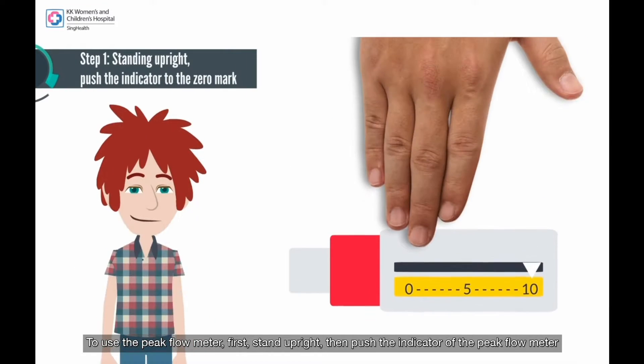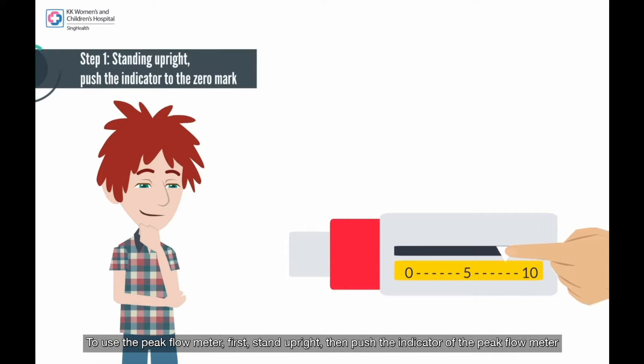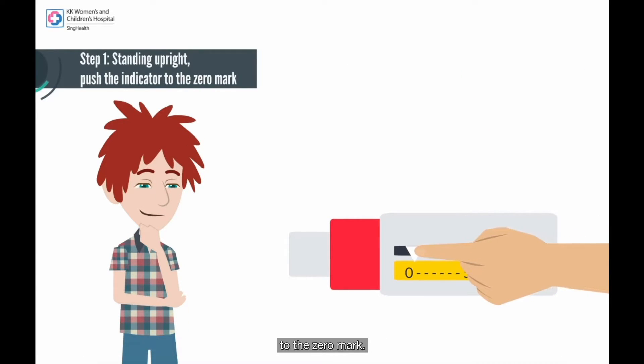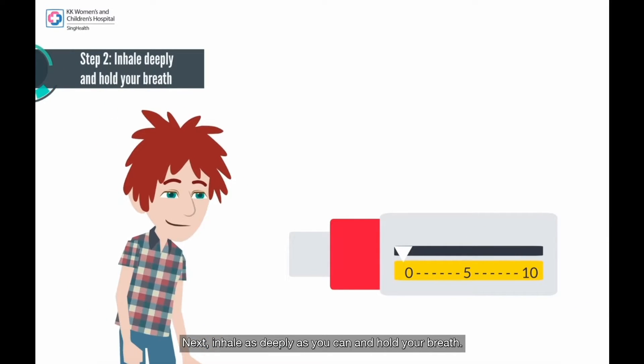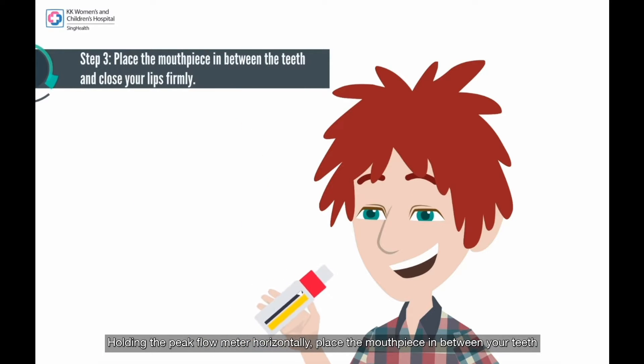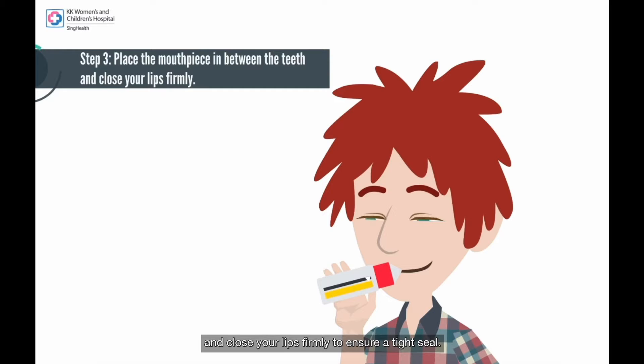To use the peak flow meter, first, stand upright. Then, push the indicator of the peak flow meter to the zero mark. Next, inhale as deeply as you can and hold your breath. Holding the peak flow meter horizontally, place the mouthpiece in between your teeth and close your lips firmly to ensure a tight seal.